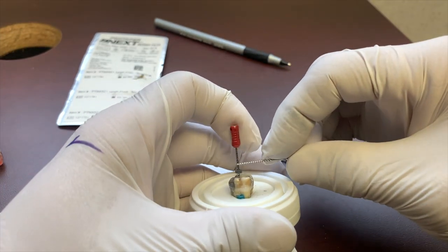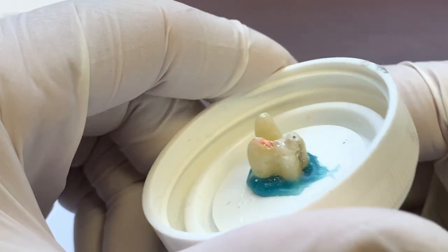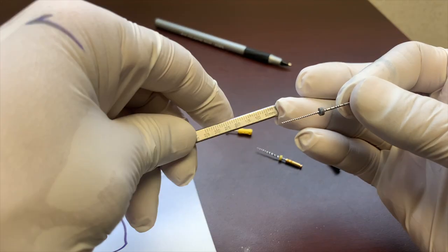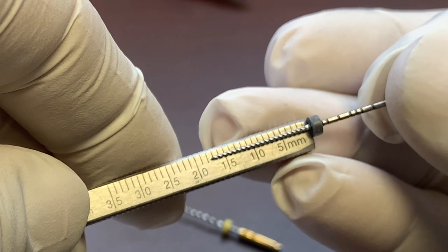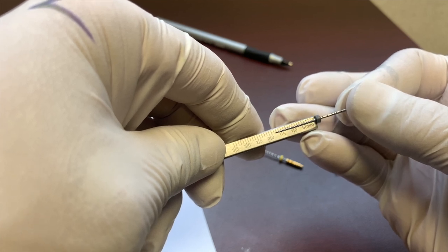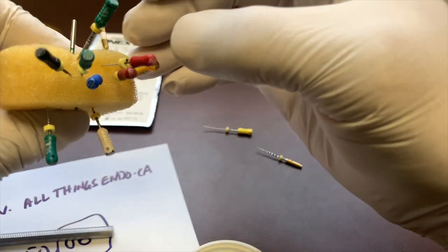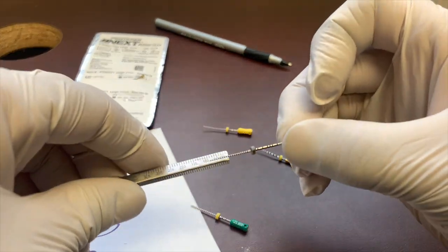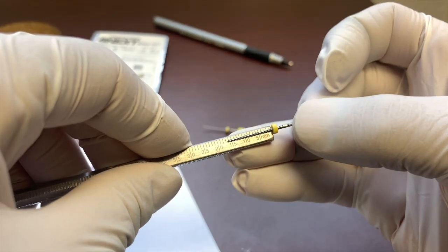And then let's place it right there. We're gonna estimate it. We can see the file right coming out. Estimate it right about there. And let's just measure it. So say, for example, our apex locator would read 17 and a half. Let's cut this to say 17. Let's do that for this case here. I'm gonna skip right to a 70, just to speed this up. Okay, so let's set our working length to 17.